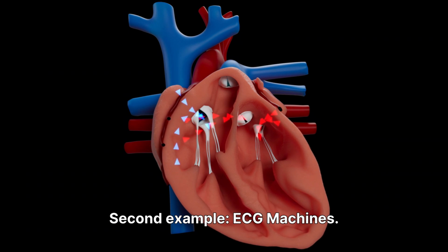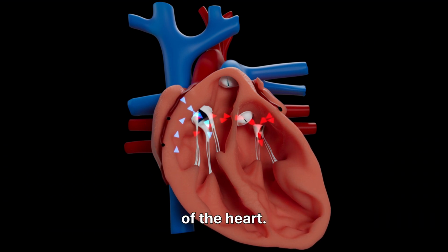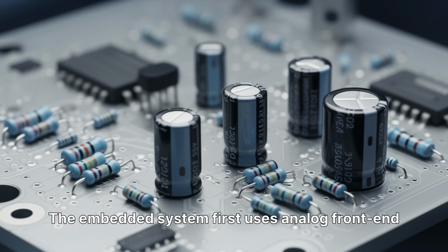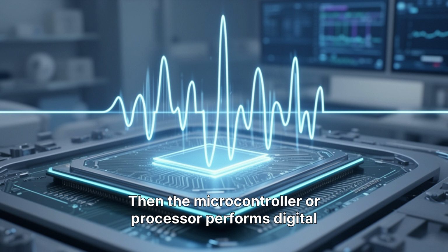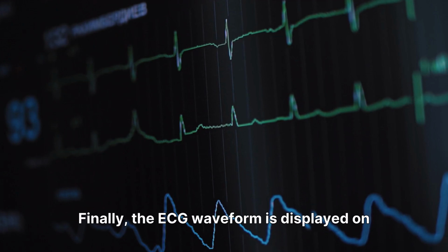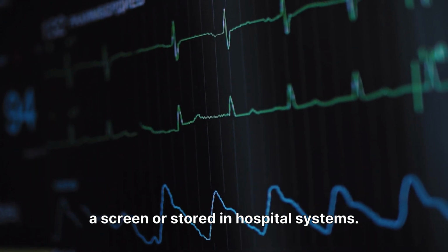Second example, ECG machines. An ECG machine measures the electrical activity of the heart. Electrodes are placed on the patient's body. These electrodes capture extremely small electrical signals generated by the heart. The embedded system first uses analog front-end circuits to amplify and filter the signal. Then the microcontroller or processor performs digital signal processing. It detects heart rhythms, abnormalities, and patterns. Finally, the ECG waveform is displayed on a screen or stored in hospital systems.